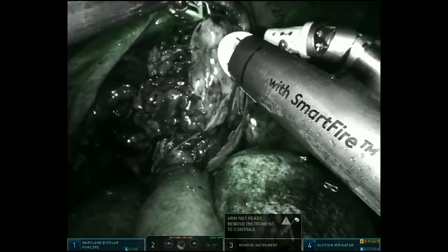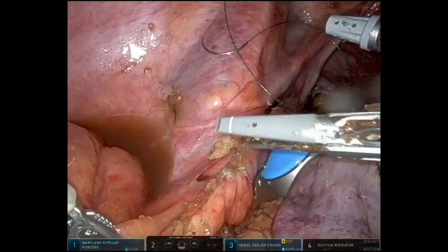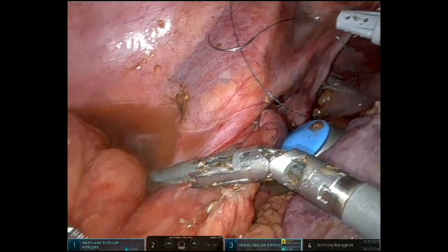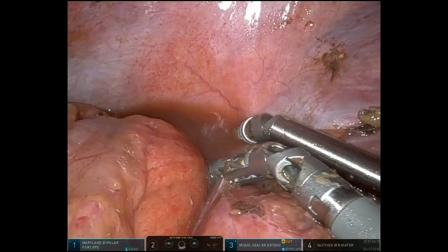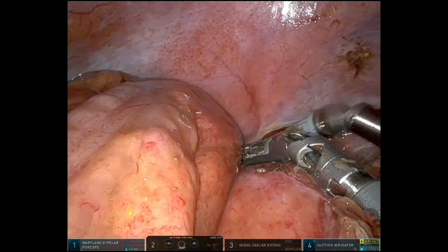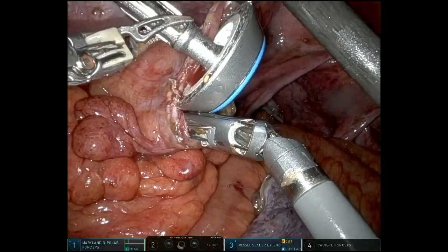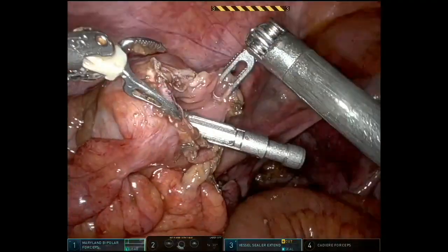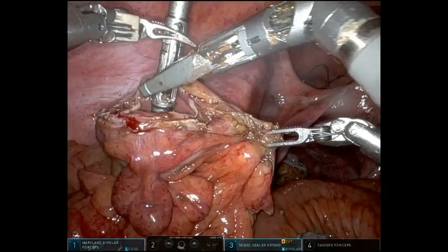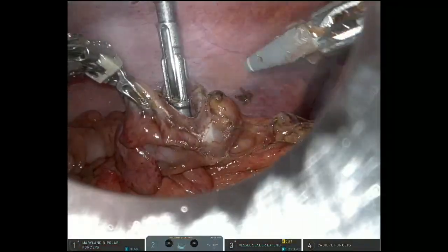We used ICG to assess for blood supply. Then we took down the lateral attachment to have a tension-free anastomosis, using a combination of suction and irrigation to clear the fluid, followed by introducing the anvil into the descending colon and preparing the area for the anastomosis.